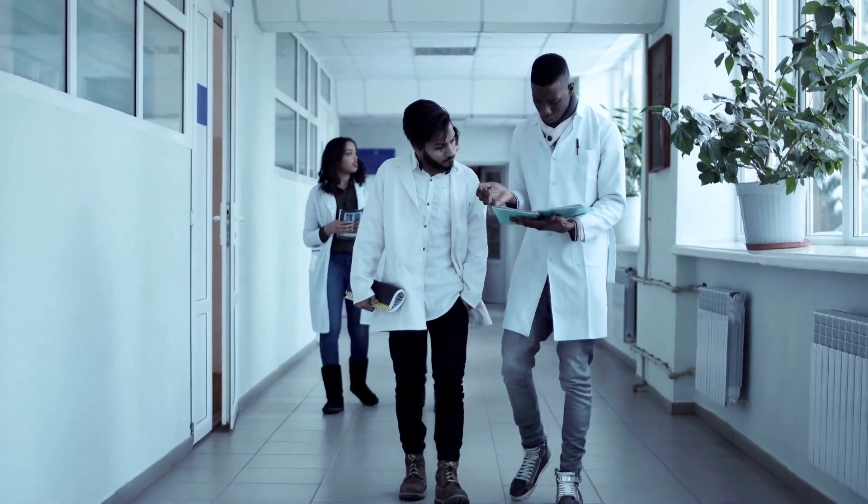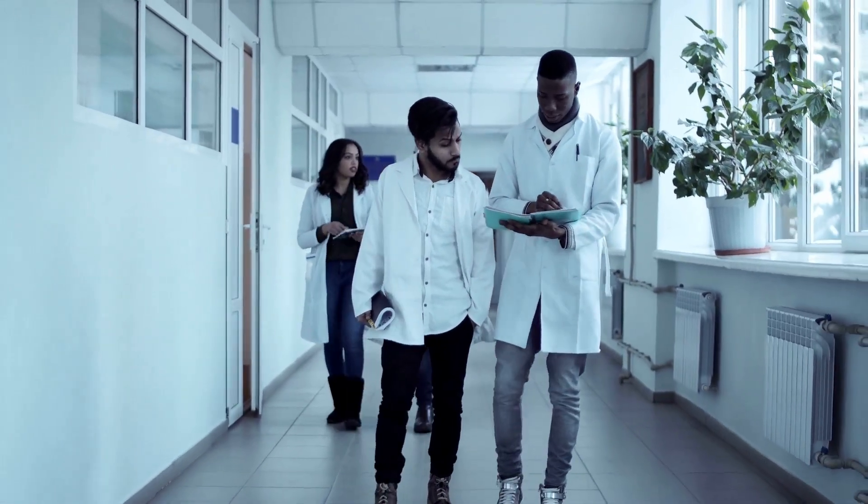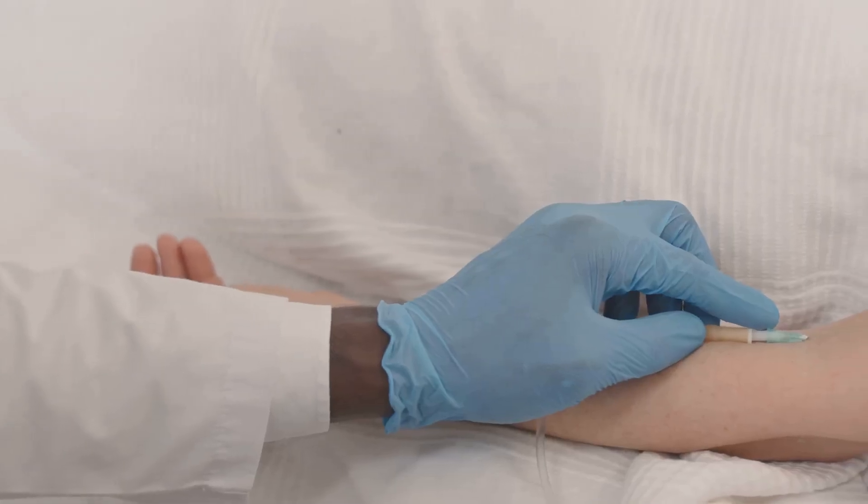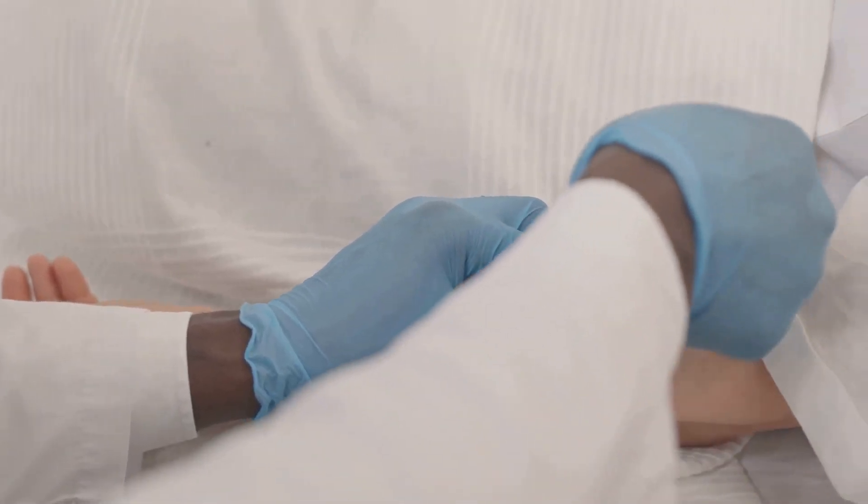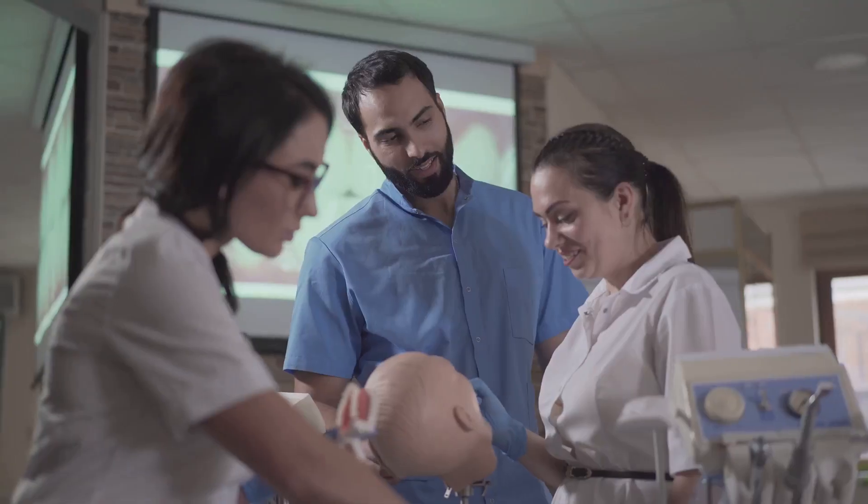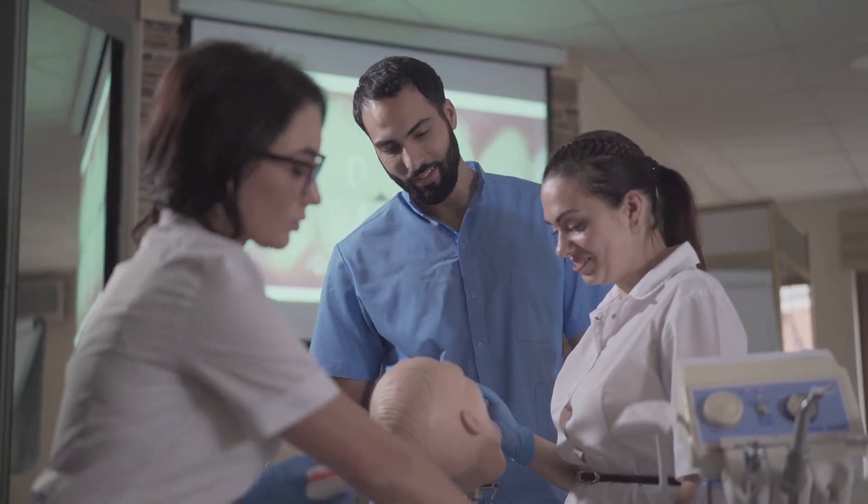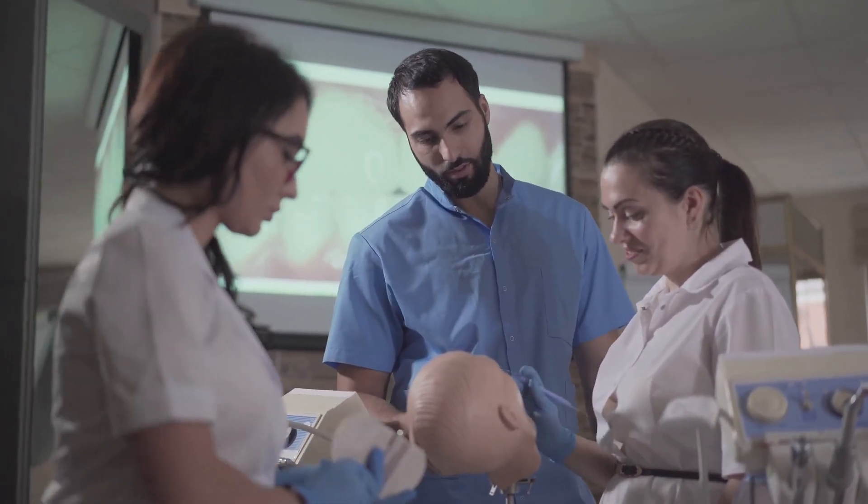Hello, future lifesavers. As student ODPs, you're about to embark on an incredible journey into the world of surgery. One of the first and most important skills you'll learn is intravenous, or IV, cannulation. It might seem a bit daunting at first, but trust me, with practice it'll become second nature.